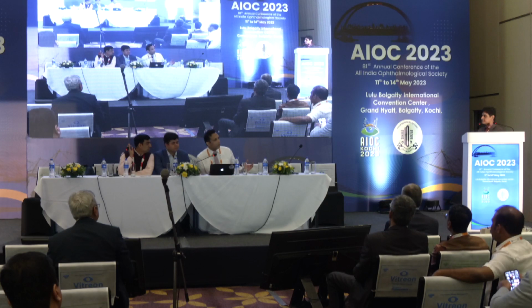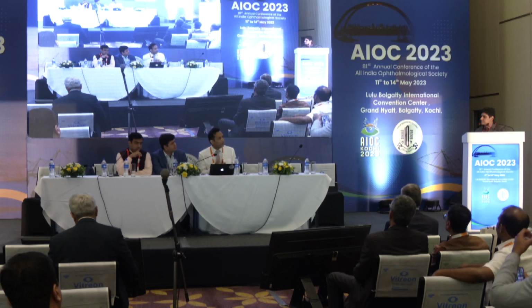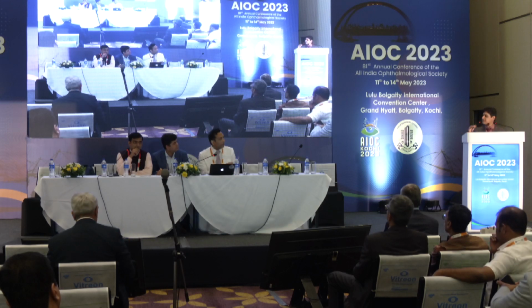See, the natural course of optic pit maculopathy is also that sometimes we see chronic cases in which the fluid has resolved with a pigmentary change. And in all your cases, you said that the final resolution was in 3 to 4 months. Vis-a-vis, if you do a plugging, it might be a little traumatic. It might create macular holes in a minor set of cases, but the resolution is much faster. Aren't you concerned about the photoreceptor degradation that, long term, it takes to resolve in a simple PVD induction technique? So, Vishal, I agree, some plugging has to be there. They will eventually resolve. The fluid will go away, but the duration is of concern.